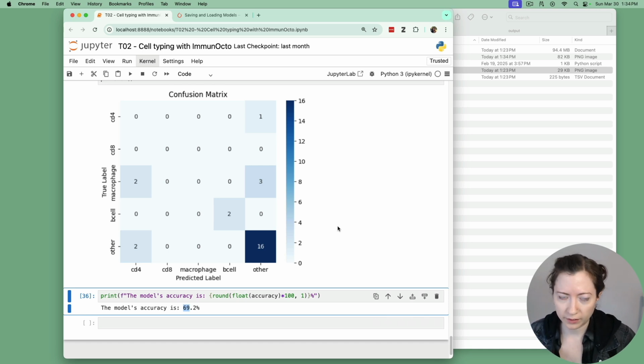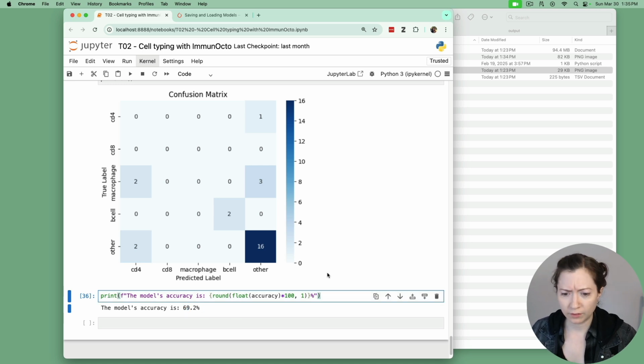This is the training process. So you've got to go through, you've got to fix things, you've got to shore things up, you've got to change some hyperparameters. You want a lot more compute. But yeah, plenty of room for improvement for sure. But this data set is a great place to start if you want to try to infer immune cell types from H&E images. So I hope you have fun.